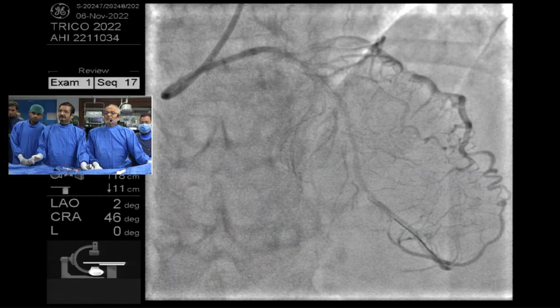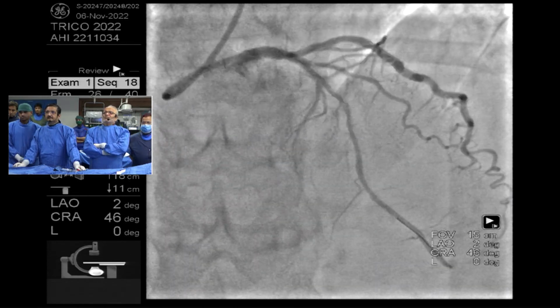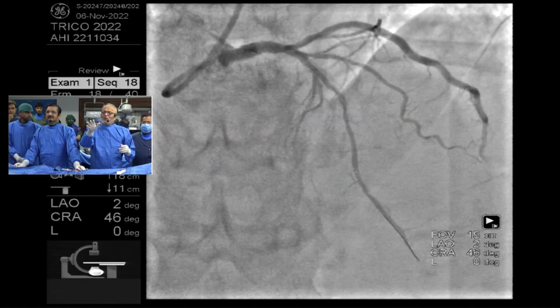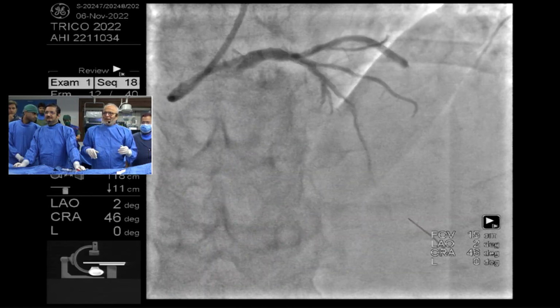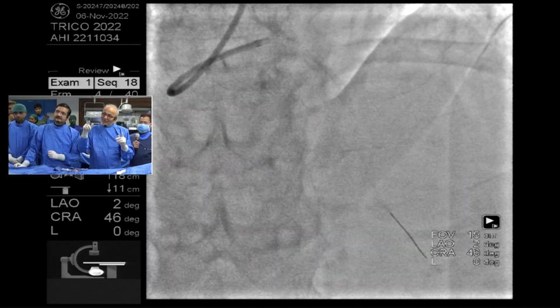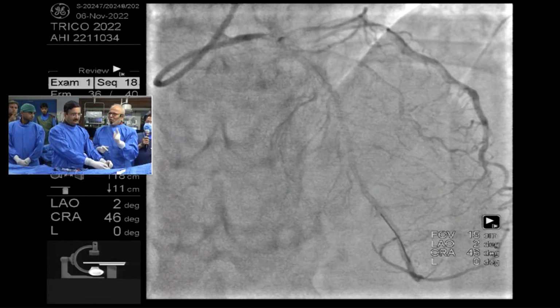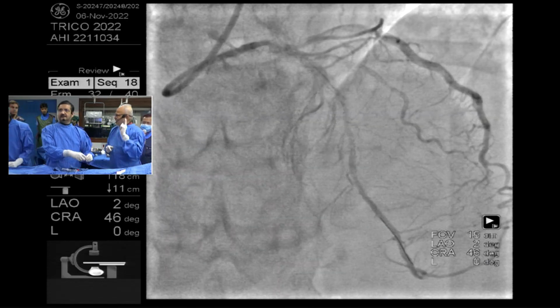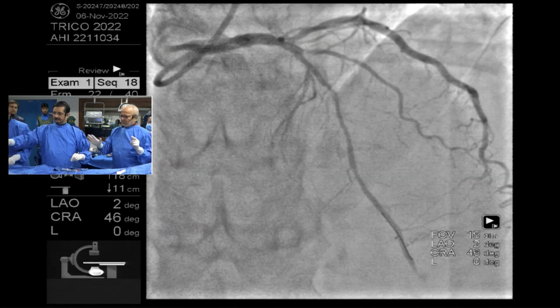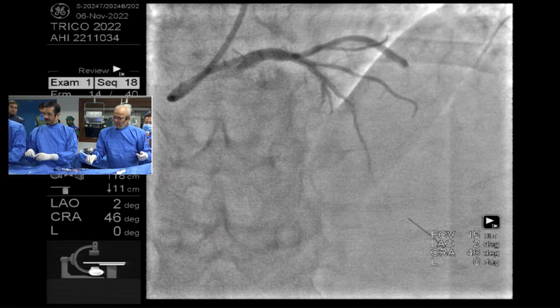Wow, it's fine. It's a big variety. So what should be the strategy now? Imaging could help. The OCT will not go in, and IVUS is not going to be helpful in this situation. I think I would do IVL now. IVL also will not go, Samir. I can try, but I will first dilate this with a non-compliant balloon. Yeah, true, absolutely. Then I will put a micro catheter. I think eventually IVL before stent. And prior to that, whatever it takes, we have to get it done. Now we have to change over the wire to a micro catheter.